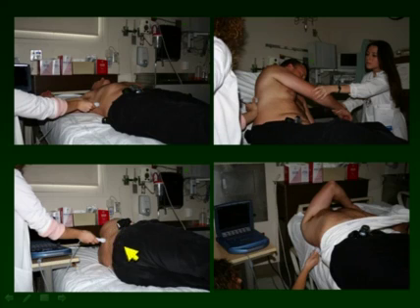To roll the patient over in lateral decubitus is definitely an option. And then to bring the patient carefully, emphasis carefully, to the side of the bed, tying them with a little sling, the operator can sit on the floor and come up scanning for the smaller effusion. We call this the garage method, as if the garage mechanic is underneath the car looking up.